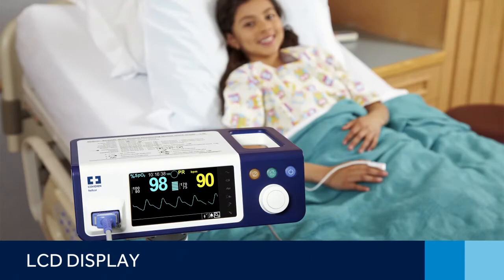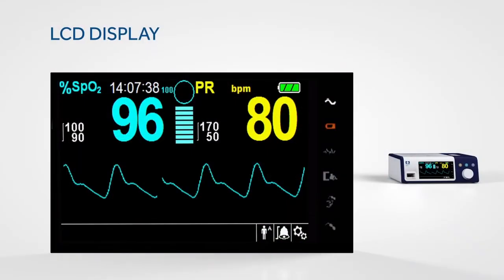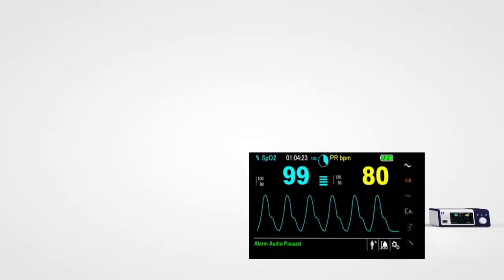The colour interface on the monitoring system is designed to be both easy to read and easy to use, so you can see critical patient information quickly. Key parameter measurements are displayed prominently. They are readable from any angle and lighting situation. This readability constitutes normal workflow in all acuity settings.